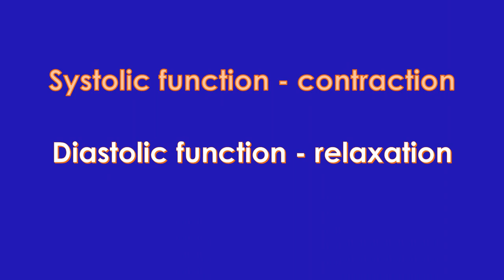An ejection fraction below 50% is considered below normal. The lower the ejection fraction, the poorer the pumping function of the heart. A normal left ventricular ejection fraction is usually reported as good left ventricular function. If it is severely impaired, it is noted as severe left ventricular dysfunction.